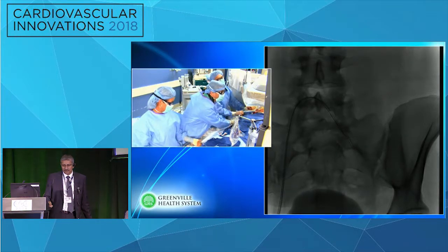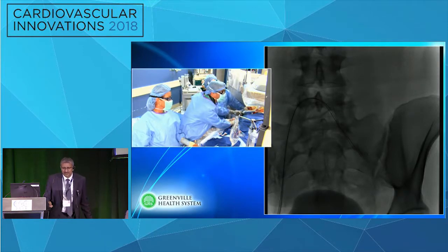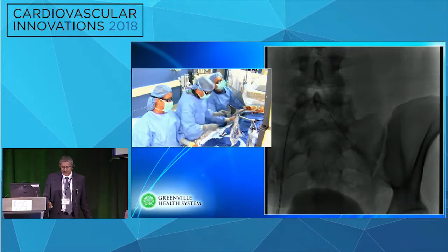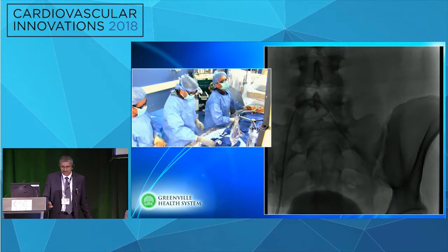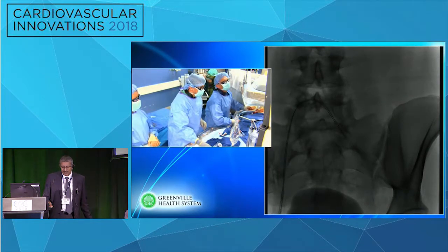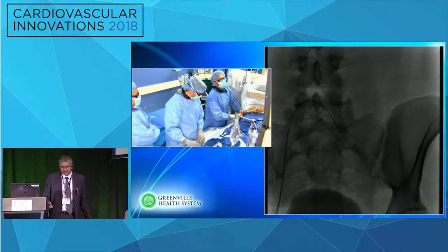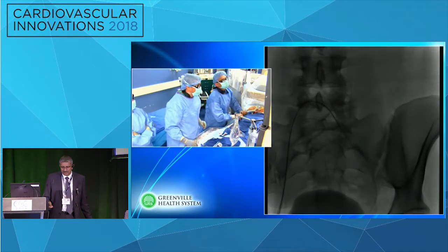That's an Ironman wire and catheter that's moving down there. That's good. More support. Let's see if we can get our little micro balloon further too. Yeah, that'd be great. What size balloon do you have supporting that wire? All right. Now we're going to see if we can get this.